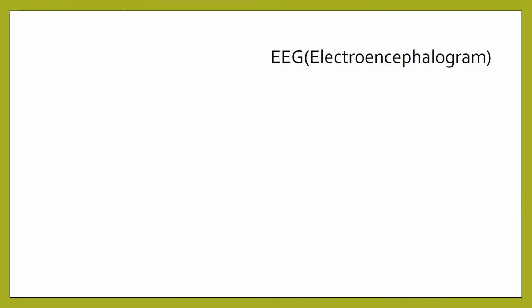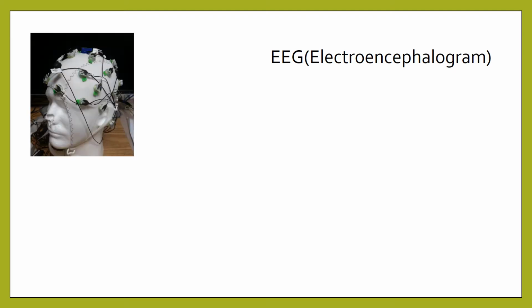The electroencephalogram, EEG for short, is the most widespread recording modality, which enables more diverse research in the neuroscience field. This recording system basically consists of electrodes, an amplifier, an AD converter, and a recording device. The electrode, made of silver chloride, acquires the electrical signal from the scalp.